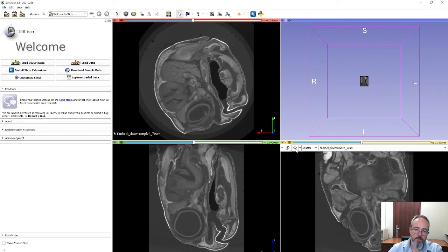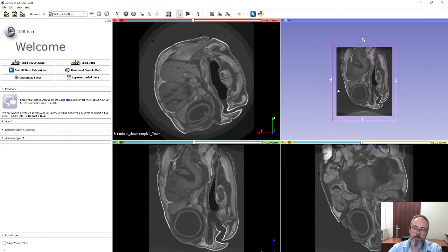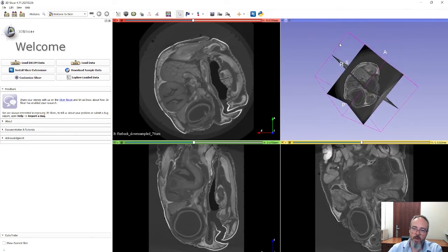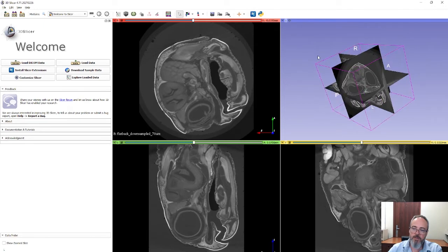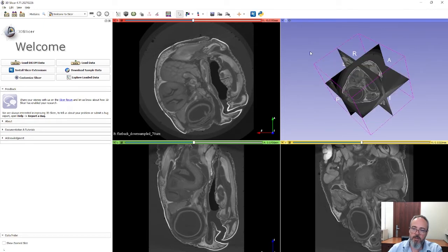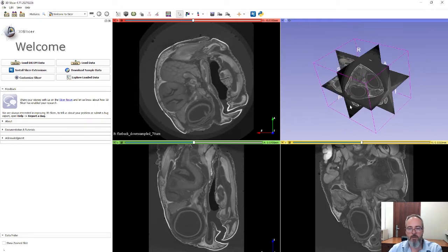Let's choose all three views so we have them all on. We want to centre this 3D view, so click on the little icon here to centre the view and zoom in a little bit. You can now see all three slices through the data displayed nicely in the 3D viewer. It's not critical but it does help you navigate yourself around.